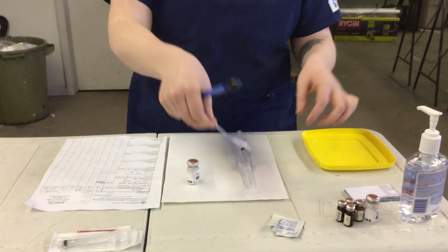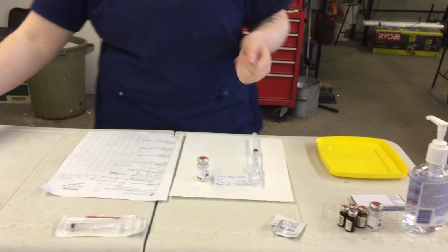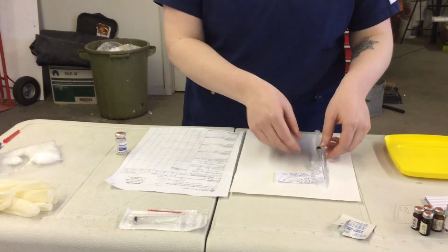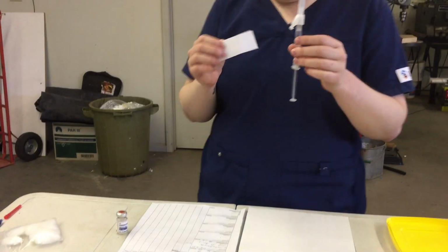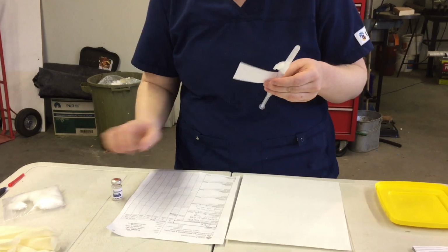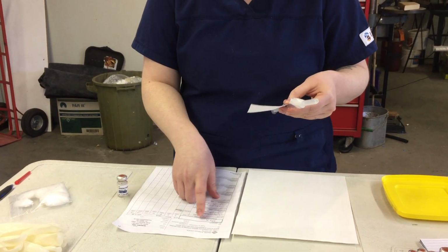I don't have the sticky labels, but I would stick this to the needle cap, but for demo purposes, I cannot do that, but I'm going to say that I did. So at this point, I'm going to go ahead and do my second check. So we have my syringe, my label, my drug, and my MAR. So we have Jake Nursing, right patient, January 1st, 1960. He has no known allergies.